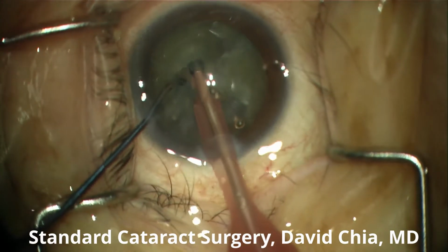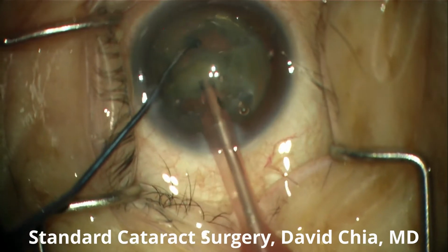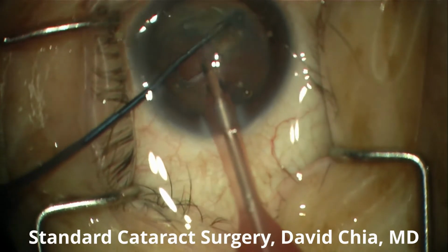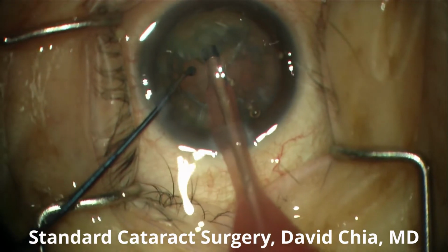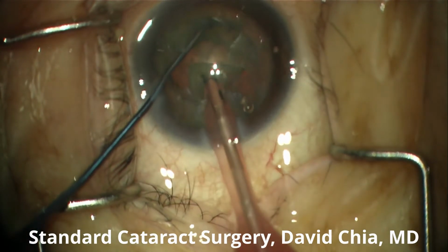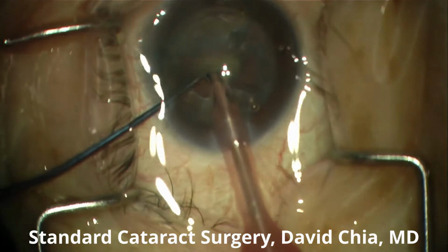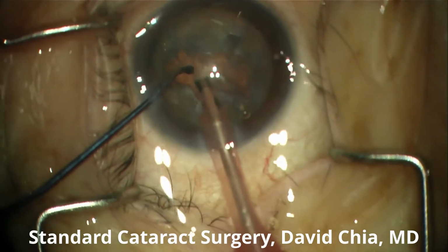And so we're moving these pieces very carefully to try to avoid excessive movement, vibration, and energy that can irreparably damage both the cornea as well as the lens bag where that intraocular lens is going to be.